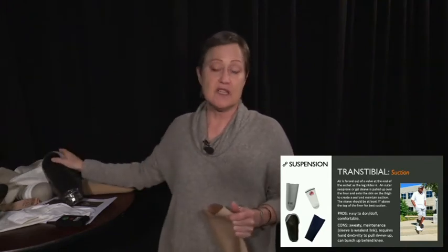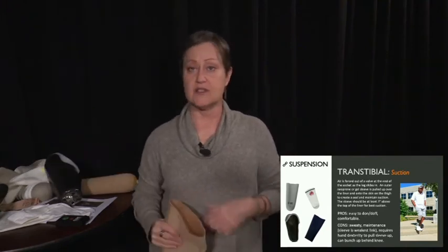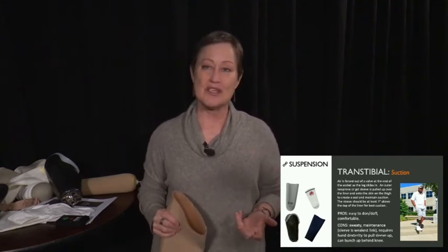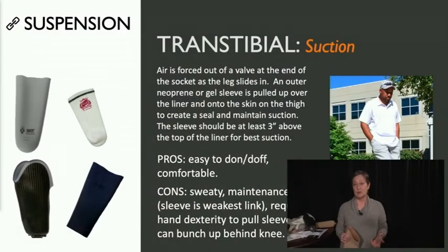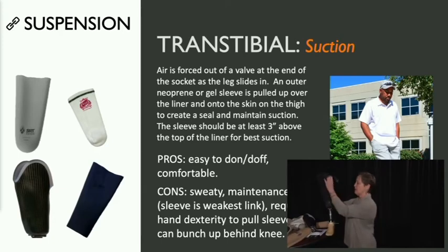You'll see on each of these slides too, there are pros and cons. So these are easy to don and doff for the most part, and they're pretty comfortable. Patients like suction a lot in the transtib level. The cons, they're sweaty, but most of these are sweaty anyway, just because they have a liner. And they use this other piece called a sleeve. So I don't have a particular slide about the sleeve, but I have one to demo to you here.